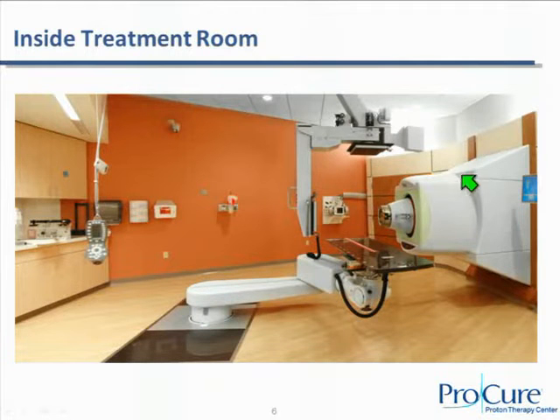We call this the nozzle, and attached to the nozzle are snouts with different sizes to further collimate the beam. You have an X-ray source, and you can see those in those two panels. This panel can swivel to this side, and you can get 3 sets of different X-ray images, 3 sets of orthogonal planes. You have X-rays in the nozzle itself, on the wall, and on the floor.